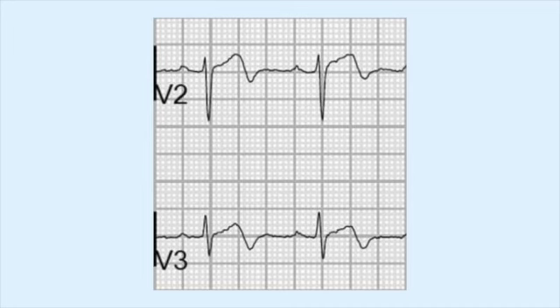Oh, but you've definitely seen it when I tell you this. So, there's a Wellens pattern A and a Wellens pattern B. I would say the one that people know the most is pattern A, which is a biphasic T wave. I have an interesting story to tell you about this, and I'll try to find it for you guys. So, chest pain patient, you take an EKG, and you see in V2 and V3 these biphasic T waves. That's supposed to be like a TIA of the heart. Does that make sense? Like tap, tap, hey there. Something's going on.